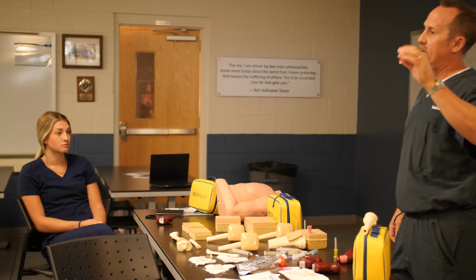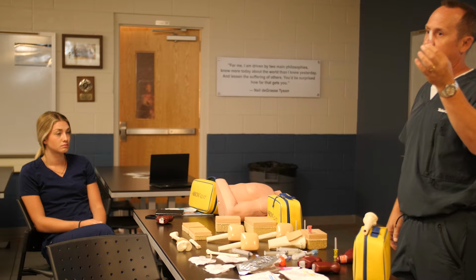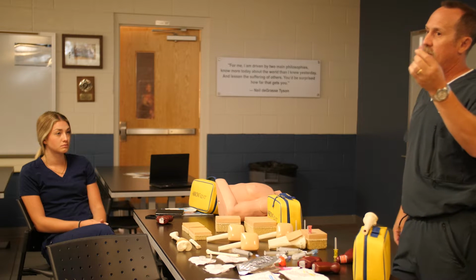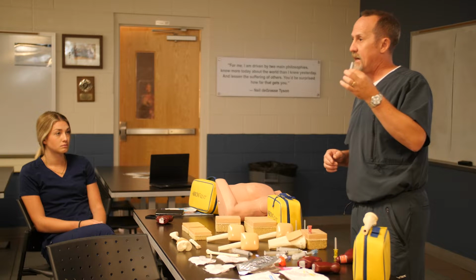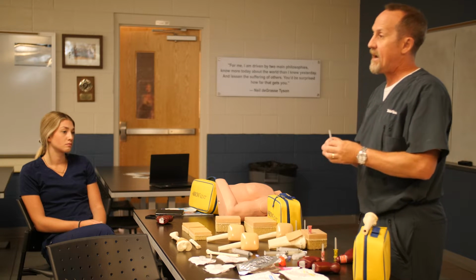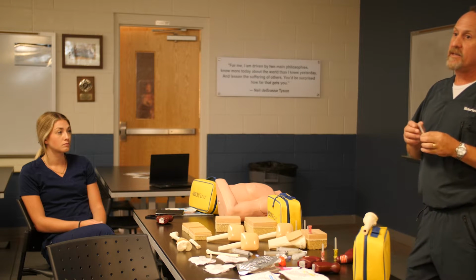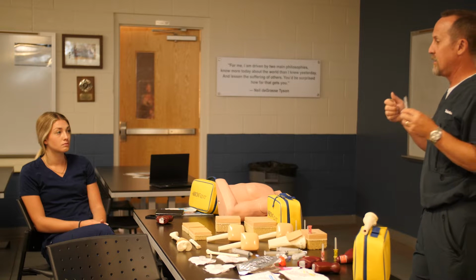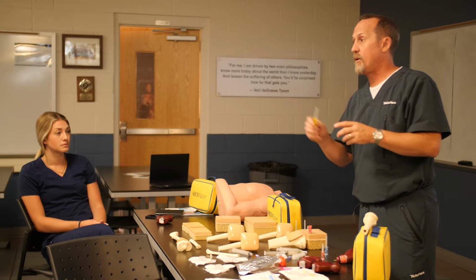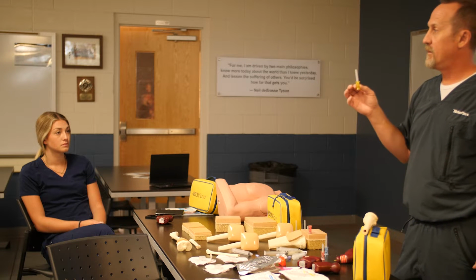I know we don't say that we have a pediatric needle, but I always kind of say pink pediatric. If you're going into a really small patient, this is going to be the target that you use, typically your really tiny little patients. The next size we have is a 25 millimeter. It's also 15 gauge, as I mentioned. This is indicated for 3 kilos all the way to the moon, okay? And then your longest needle, which is the 45 mil, is actually indicated for 40 kilos and up.